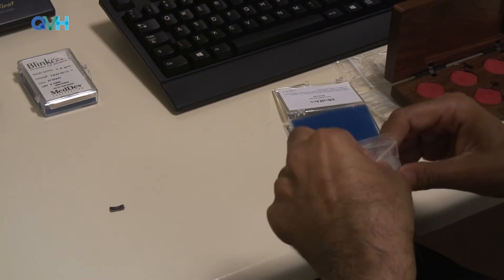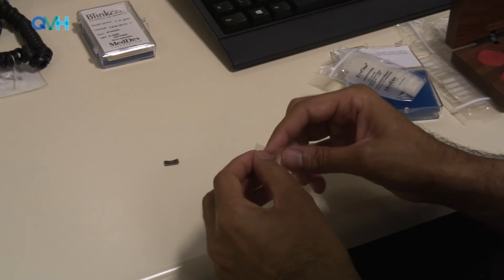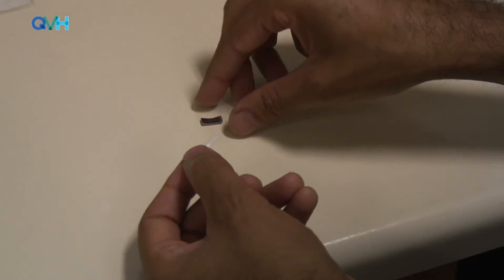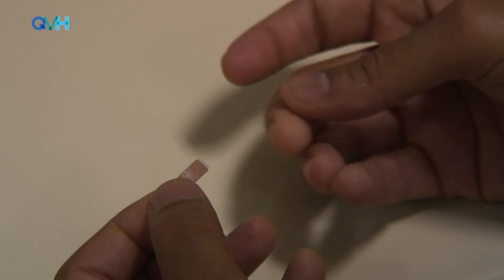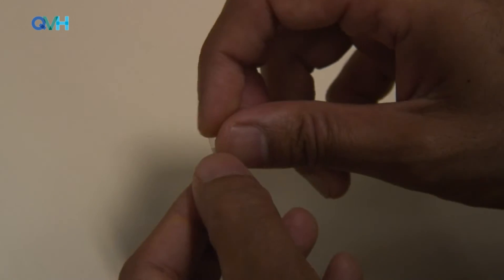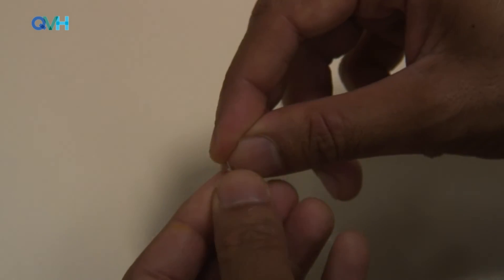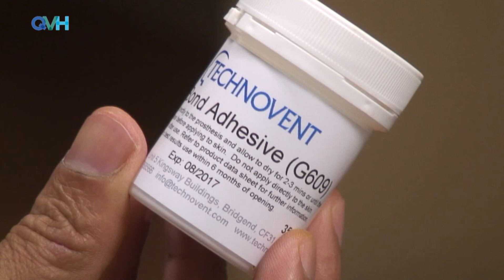They are supplied in this instance with a double-sided adhesive strip that can be reordered from the company if and when required. However, I should point out that we have audited a number of methods of maintaining these external weights on the eyelid throughout the day and have found that medical glue is more effective than double-sided tape.